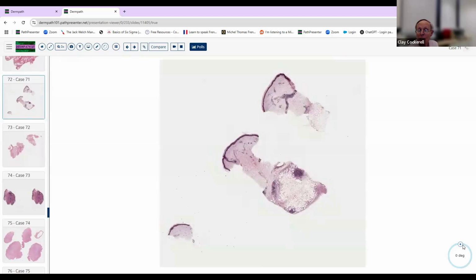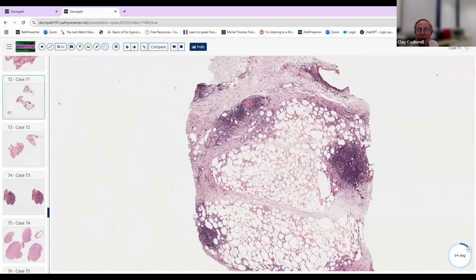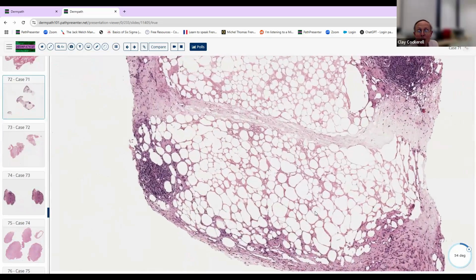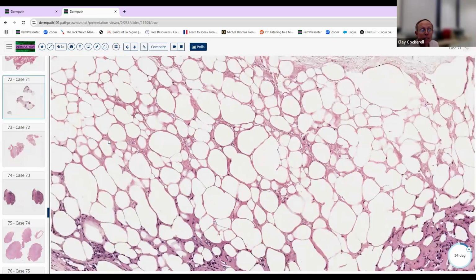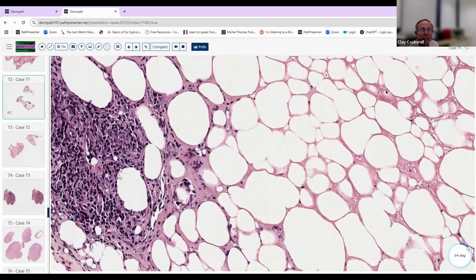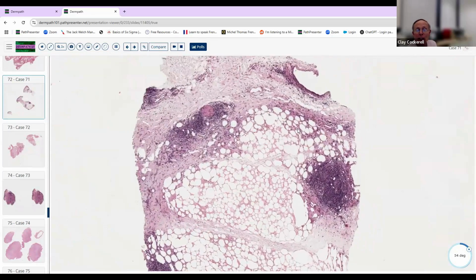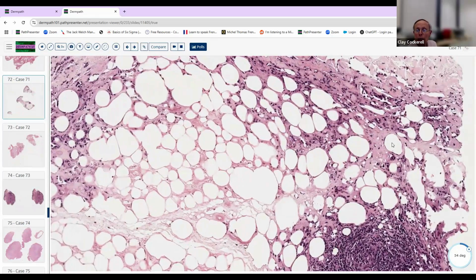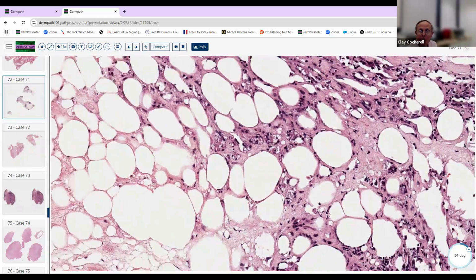Another panniculitis, lobular panniculitis with fat sclerosis and hyaline degeneration of the fat, with these aggregates of lymphocytes and plasma cells at the periphery. Classic example of lupus erythematosus profundus. Lupus profundus, hyaline fat degeneration.